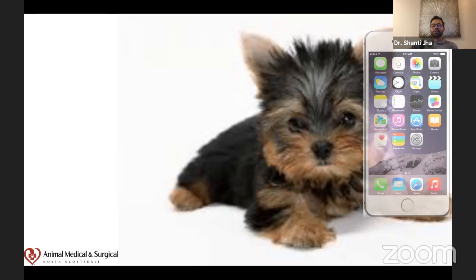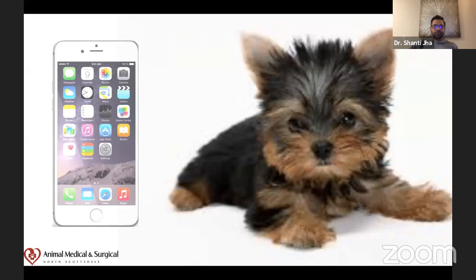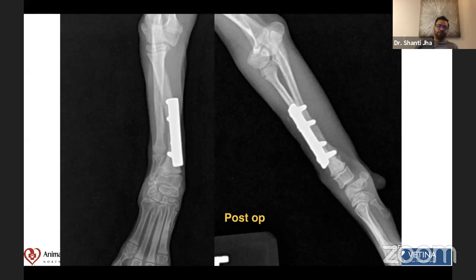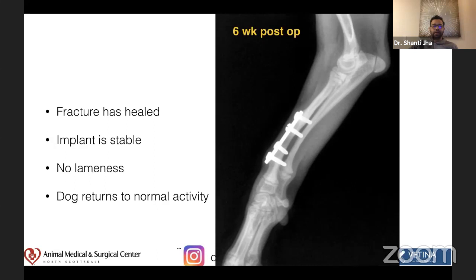Okay, so a 4-month-old Yorkie presented with a radius ulna fracture. The pet parent accidentally dropped his iPhone on him, and the dog yelled, of course, and was immediately lame in the left front. So the dog came in and the fracture repair was done. It's a DCP and I didn't do this fracture repair. I saw this dog later. This was done by a surgeon and then the dog went ahead and actually healed. So this is 6 weeks post-op. You can see that the implant is stable and healed. There's no lameness. Dog is running around doing its normal activity.